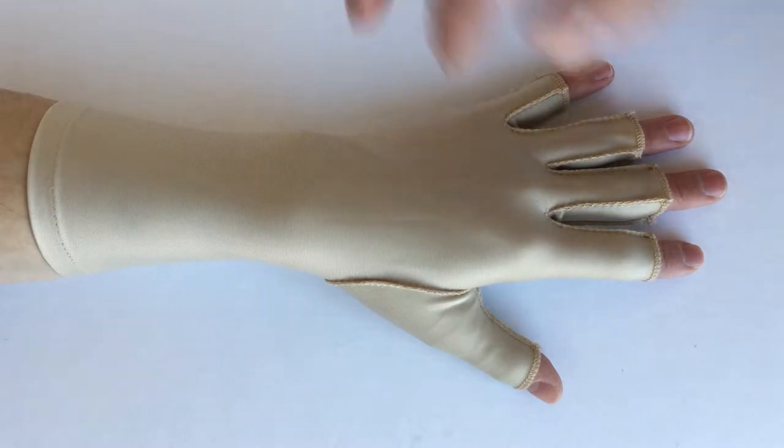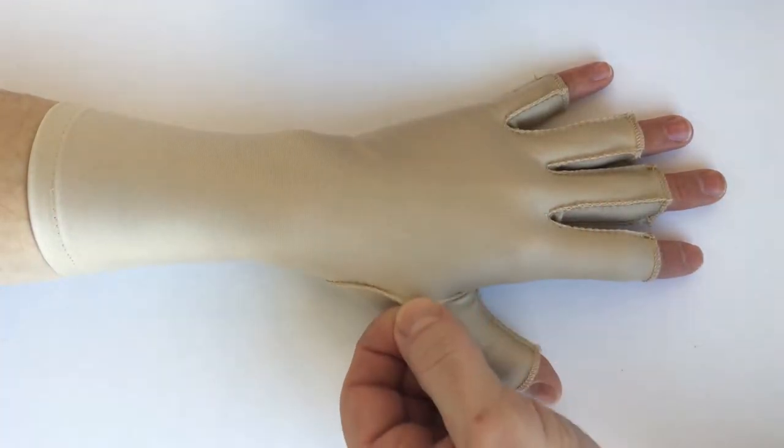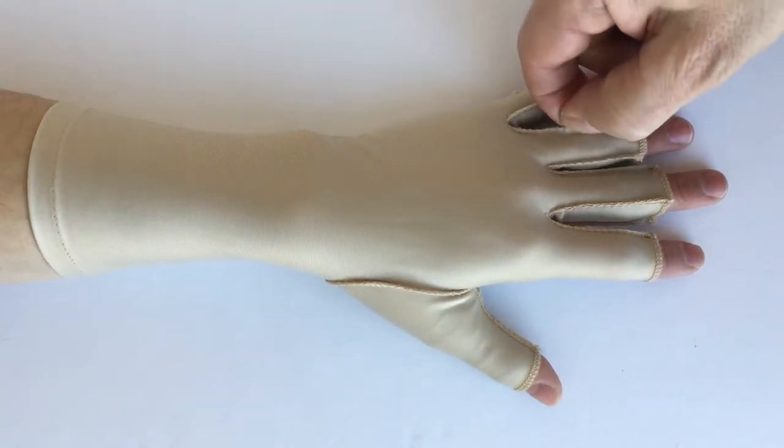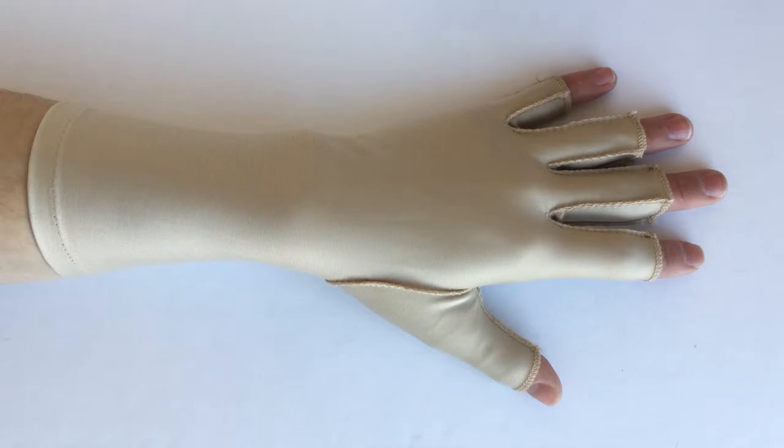When using an edema glove, the seams go on the outside and you can just tug on a seam a little bit to see if you have adequate compression. You want the edema glove to be snug but not tight.